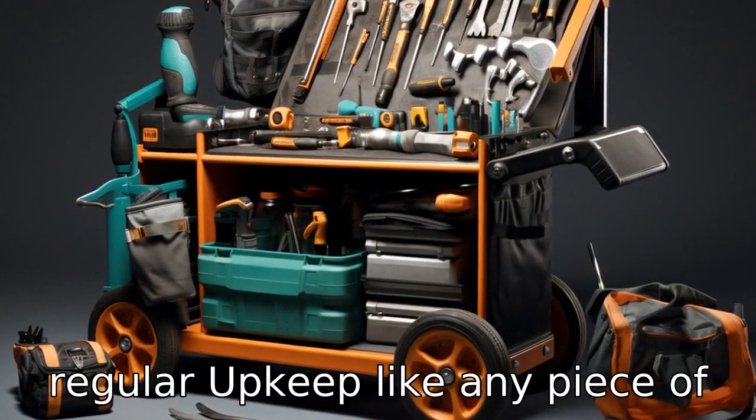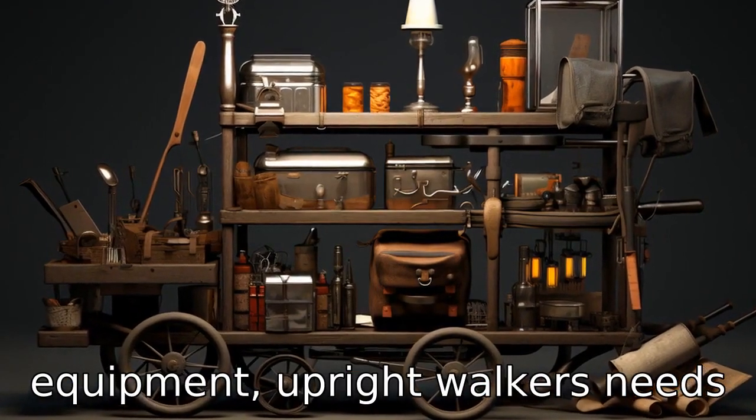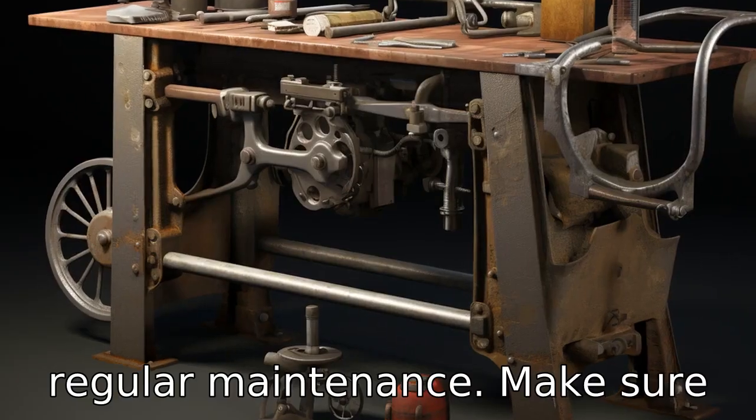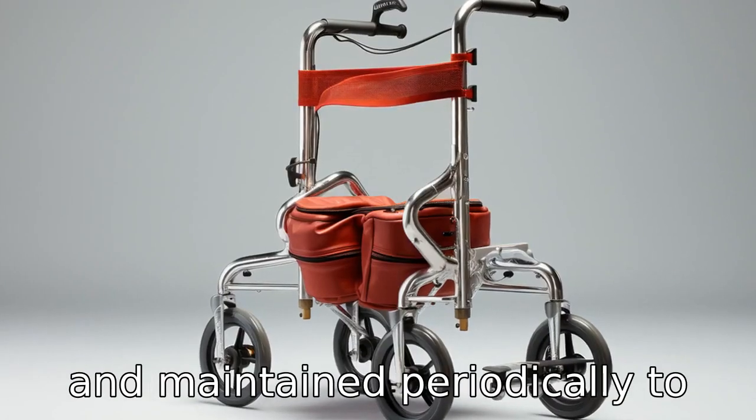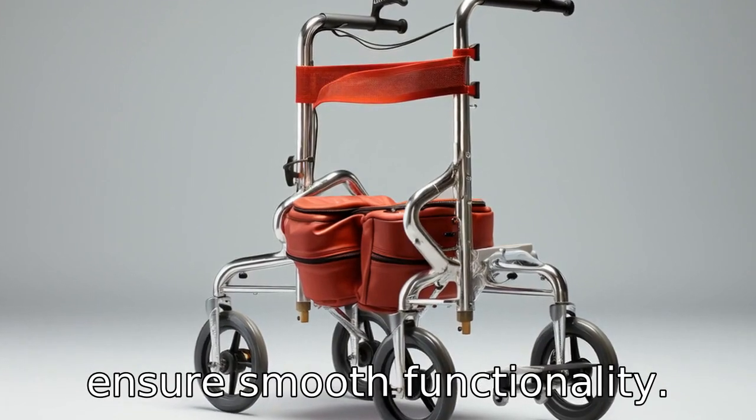Tip 7: Get regular upkeep. Like any piece of equipment, upright walkers need regular maintenance. Make sure that all the parts of the walker — like the wheels, handles, and brakes — are checked and maintained periodically to ensure smooth functionality.